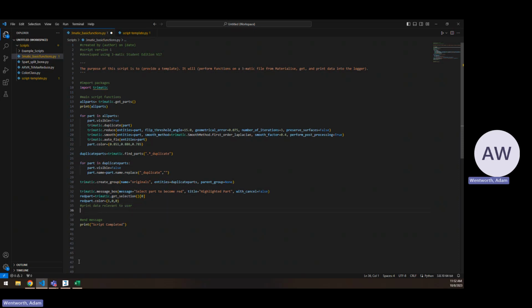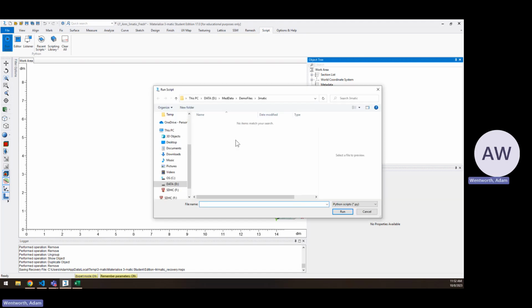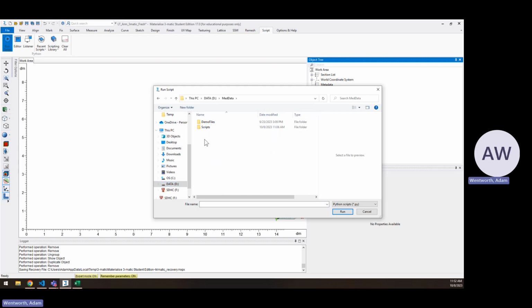So as we're writing functions in our script, if we're writing anything new, you'll see this little white circle up here. And if you want to run it as the whole script, you should hit Control S to save it. So let's run the script on this set of parts and see what it does. To run the script, we go under the script tab here, hit run script, and then we will find it. So wherever your scripts live. And I've called mine 3-matic basic functions.